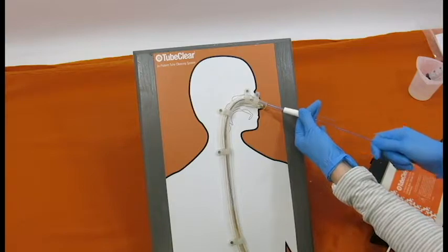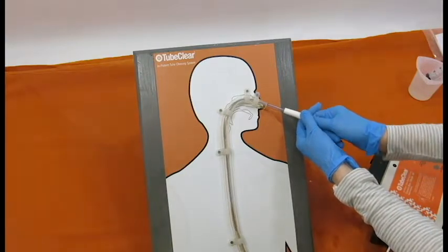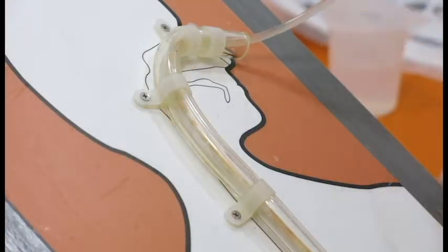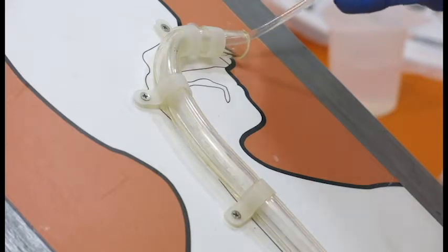A longer stroke technique is used to clear these sticky clogs. With proper technique, viscous clogs can typically be cleared in less than 20 minutes.